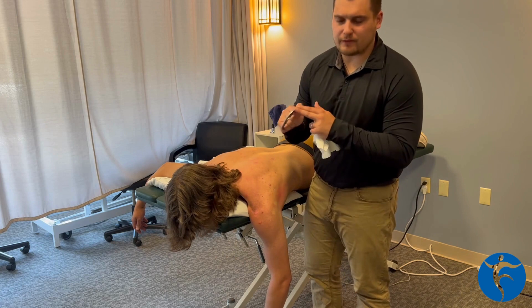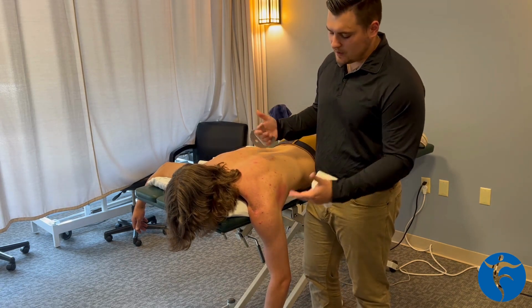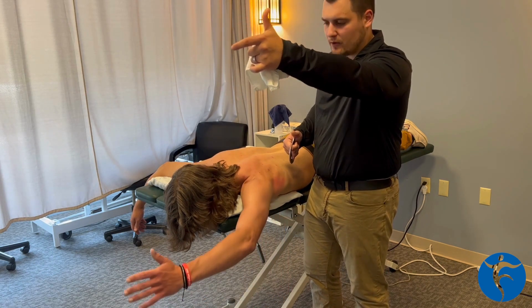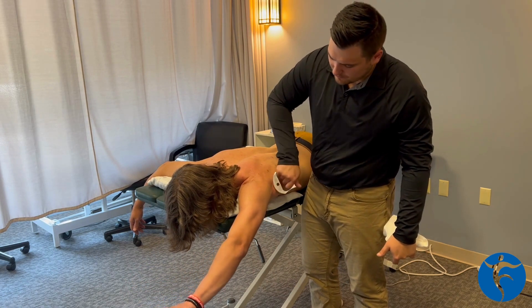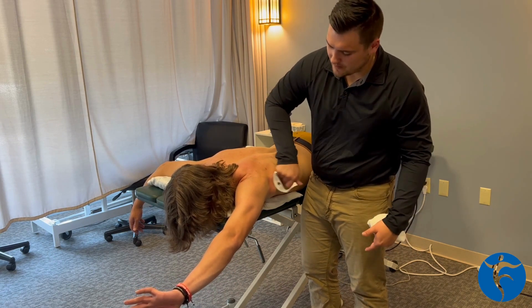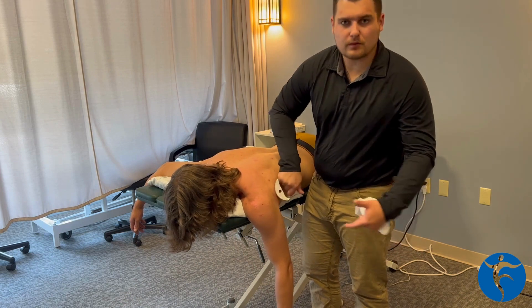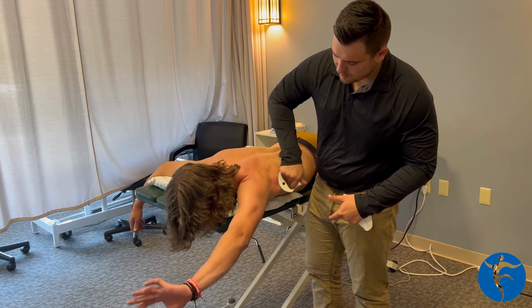With this area, I like to use the big flat edge. Now to increase the amount of release that you can get, I'll have Andrew lift his arm up, thumb up. Once he gets to the top, I'll have him turn that hand over, thumb to the ground, which is going to increase that release feeling, and then he'll come back down. They'll go back and forth and back down. You can have the patient go at their own pace.